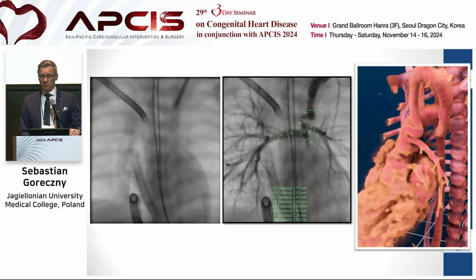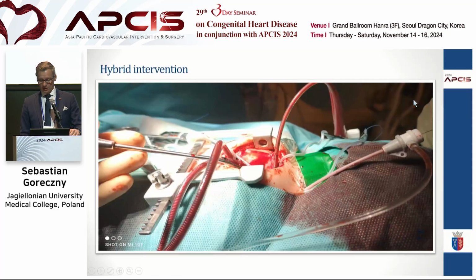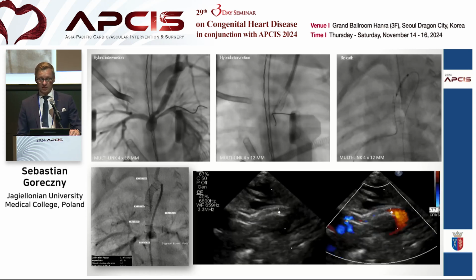Pulmonary arteries are small. If you look at the projection, well, narrow, perhaps tortuous, but bear in mind, if you look at the lateral, quite tortuous there. So that's the sheath he placed for me. It was very kind of him. And then two stents, but unfortunately the sheath was already in the duct. So I had to go from femoral vessels to stent the proximal part of the duct.